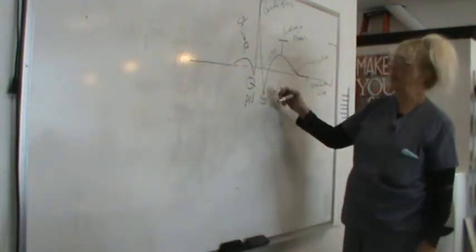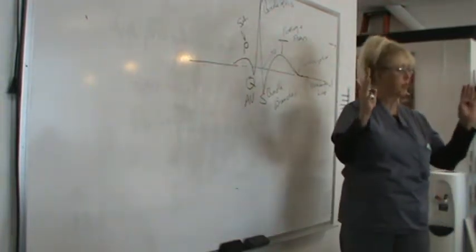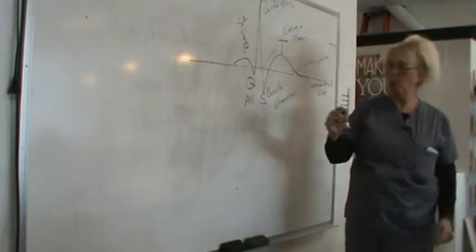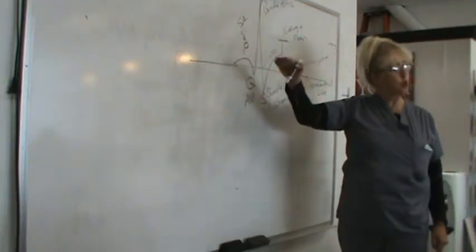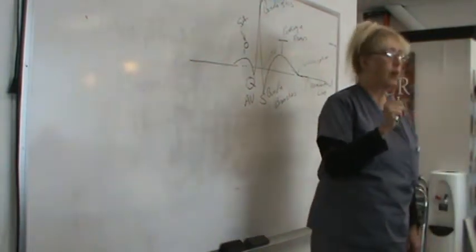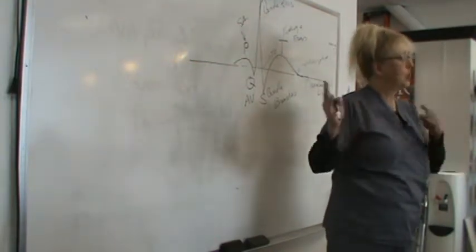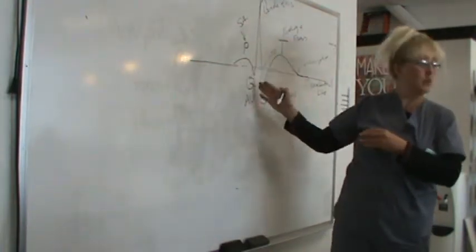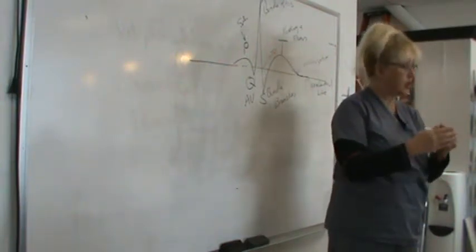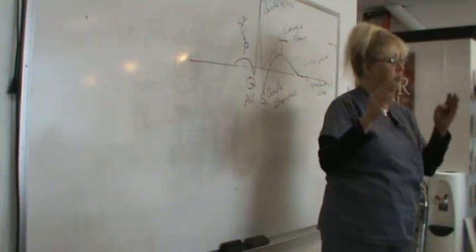Now the other thing you need to know is if this is translated on a piece of graph paper or EKG lead paper, we're going to count because there are normal distances. This is how we determine whether or not a rhythm is normal or abnormal, by the distances between the different labels that we have here, okay? And it's been accepted in literature that there are normal variations for each of the distances.